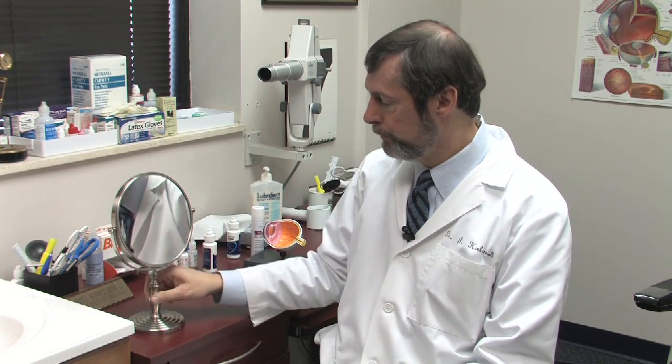A lot of people use a mirror in order to see where they're touching, but once you get the hang of it, you don't really have to use a mirror to take a contact lens out. If you have an eye which is somewhat dry and it's not coming out, you can put in a lubricant drop in order to help. That doesn't happen very often, but it does help.